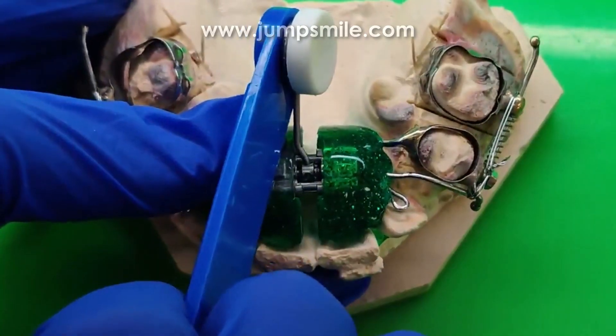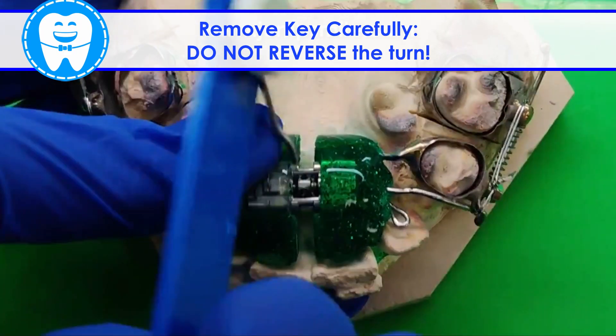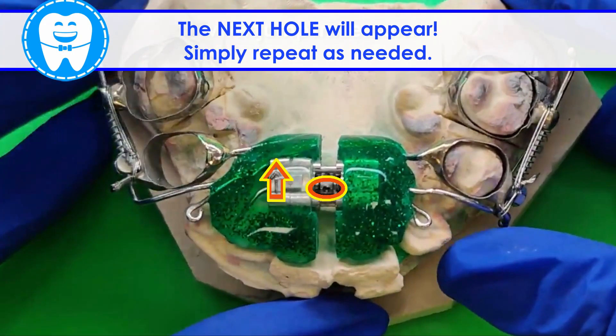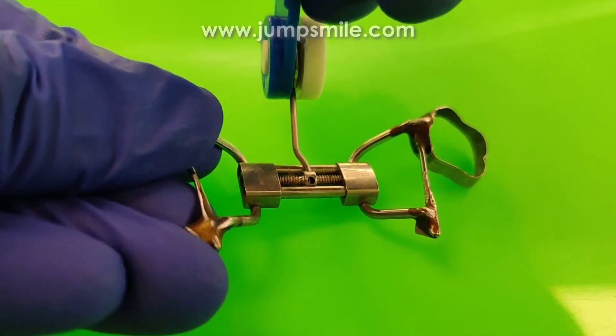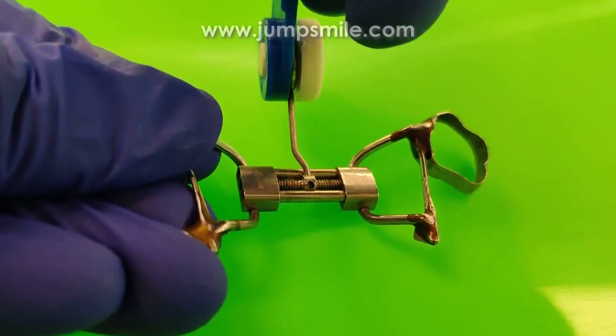Remove the key from the back. Be careful not to reverse the turn. Look for the next hole so that you know the turn is complete. You can repeat as needed. If your key feels a little stuck after the turn, a gentle wiggling motion of the wrist will help remove it.